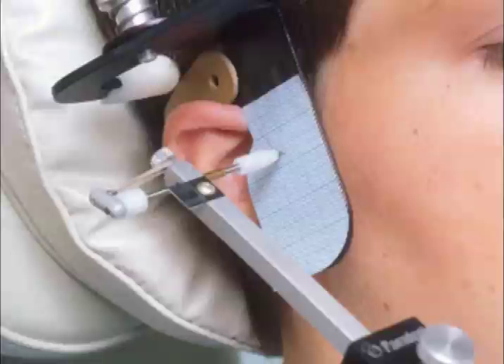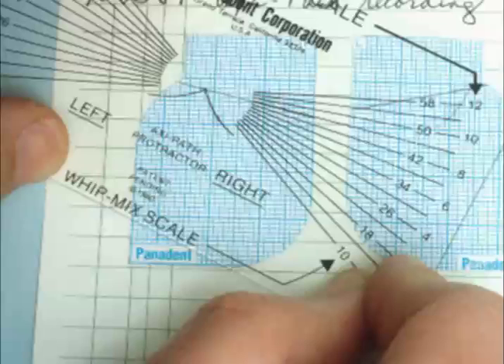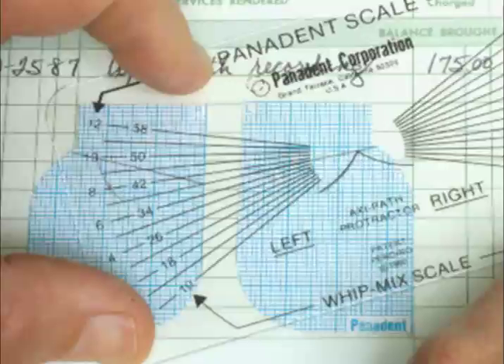And we can record this protrusive pathway by using our AxIPath recorder, which traces the protrusive pathway as the patient slides forward and slides back. We can then superimpose the protractor onto the patient's pathway here, and then read the axis orbital reference line out to the patient's condylar inclination on the right side. We can do the same thing on the patient's left side, superimposing this protractor onto the patient's pathway, reading the reference line out, getting the inclination of the patient's left side condylar inclination.